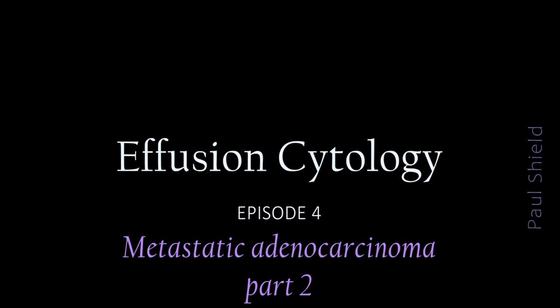First pattern I want to look at really is a mucinous pattern. So some very well differentiated tumours, metastatic to the peritoneum especially, produce a lot of mucin and have really very little in the way of nuclear atypia. There is one condition that derives from this, which I'll talk about in the lecture, called pseudomyxoma peritonei, that can be quite difficult to diagnose.